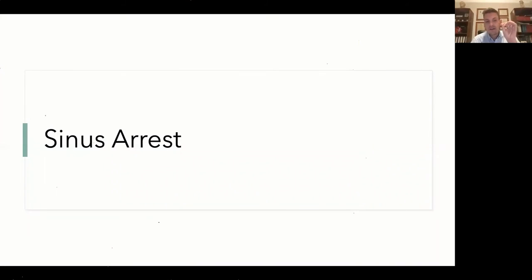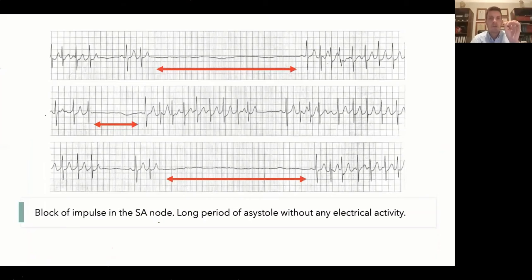Now, this is more complicated and more directed towards clinical practice. So I'd like the older students in the audience to take care of this, please. This is an internal medicine exam strip, okay? As you can see here, the ventricles are firing and the atria are firing right here. So P wave, QRS, okay? And here there is a pause, okay? We call this pause asystole. Why? Because there is no contraction of the heart occurring. It's quite simple. But then it starts firing again.